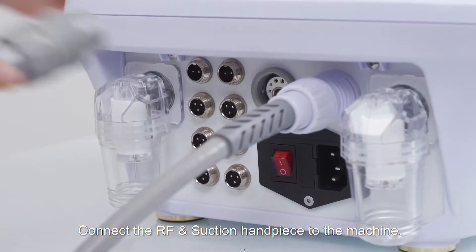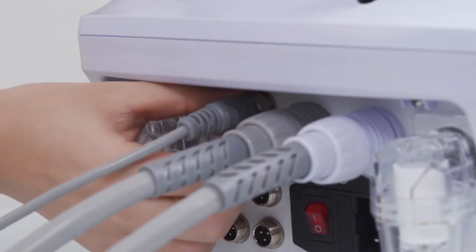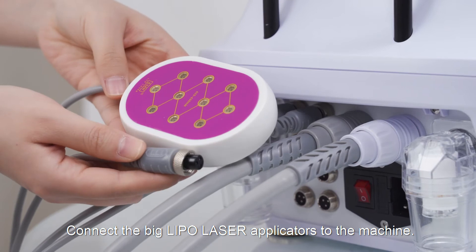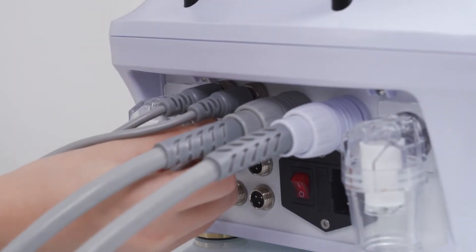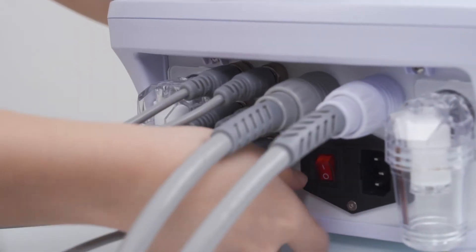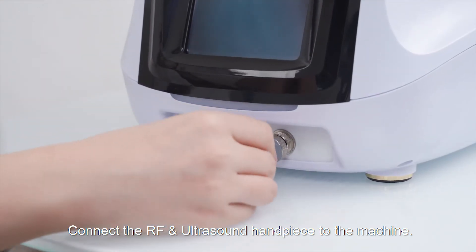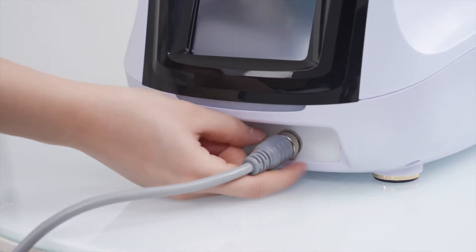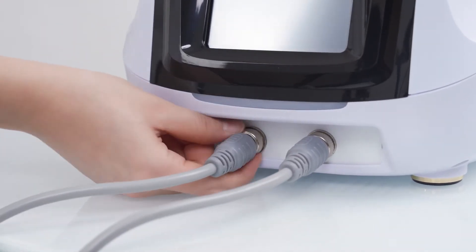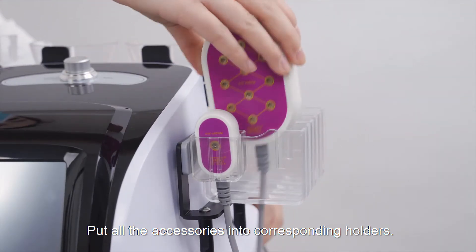Connect the RF and suction handpiece to the machine. Connect the small lipo laser applicators to the machine. Connect the big lipo laser applicators to the machine. Connect the RF and ultrasound handpiece to the machine. Connect the EMS and EL handpiece to the machine. Put all the accessories into corresponding holders.